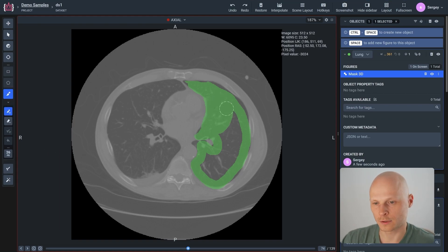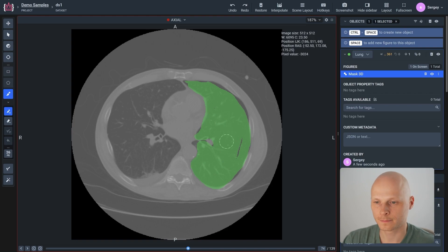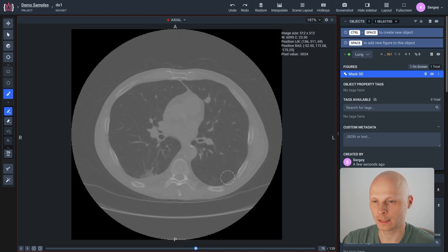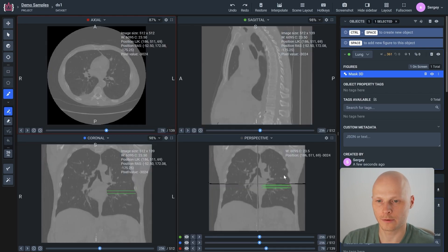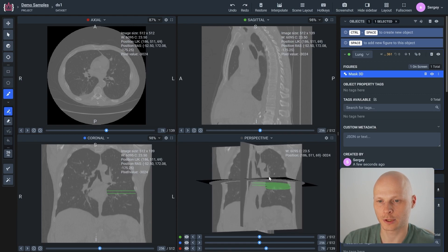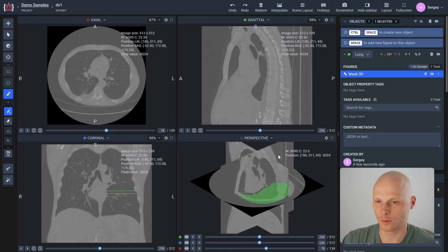We can go through the different slices and label the objects on them. As you can see, the labeled slices are also visible in different projections such as 3D representation.